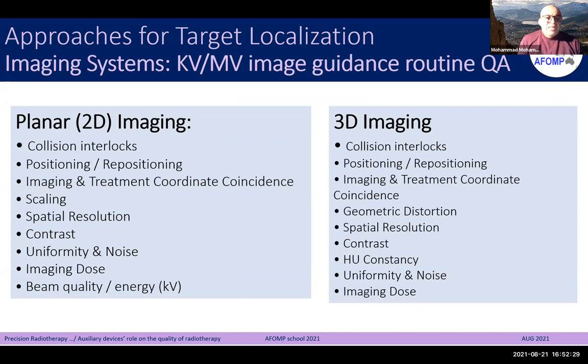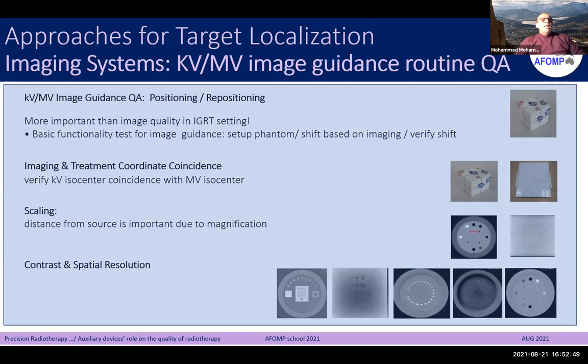Some tests are recommended for 2D planar imaging and 3D imaging section because software is included, and in some sections they are different, including mechanical and safety and imaging control. And here you can see how we can do that, just easily as a daily check using a cube test. Easily you can do that with one image.